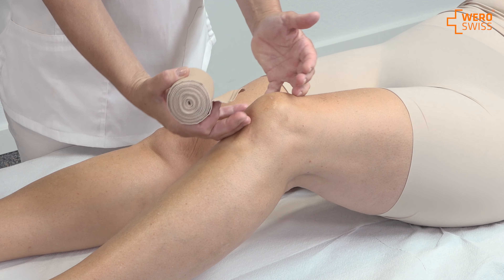I'm continuing back on top of the knee patella, continuing under the knee and down under the patella. I keep doing the figure-eight, overlapping.